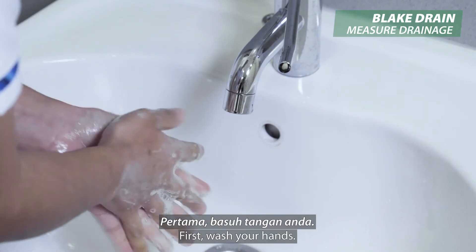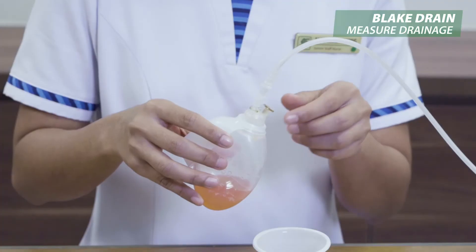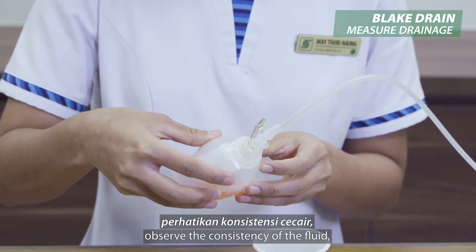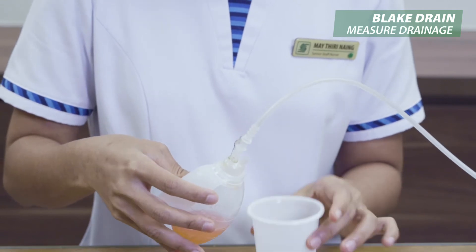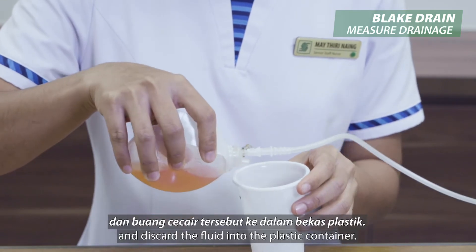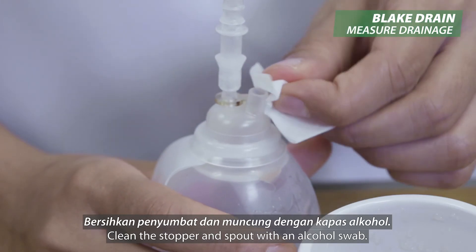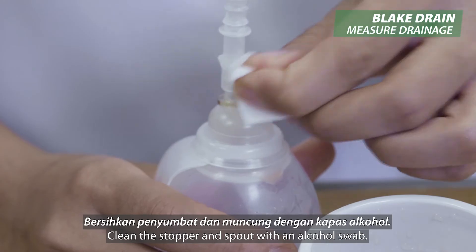First, wash your hands. Open the stopper. Observe the consistency of the fluid and discard the fluid into the plastic container. Clean the stopper and spout with an alcohol swab.